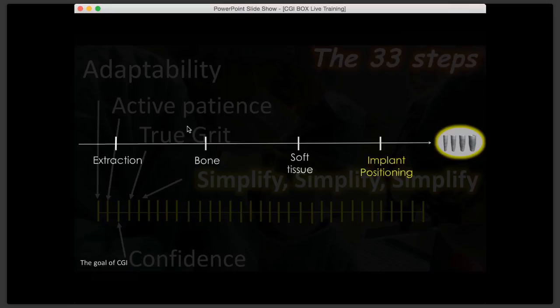Okay, each file, and you'll have about, let's say for a full arch, you'll have about 100 to 200 files, and it depends on the thickness of the slices. Like Anthony is saying here, you don't have to have slices that are that thin, 0.1 millimeters. You don't need that, and that's going to slow down the work with the software.